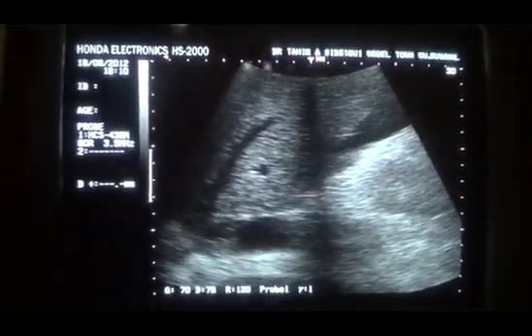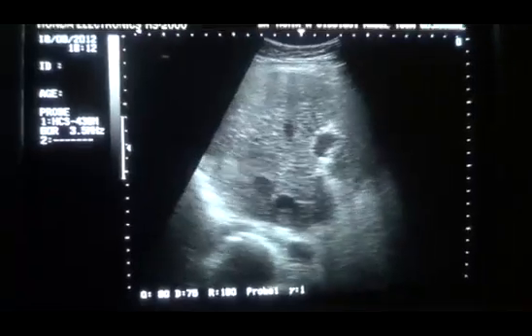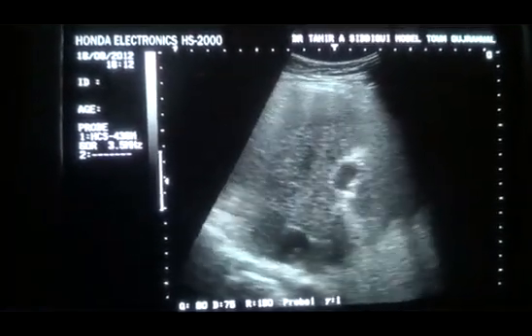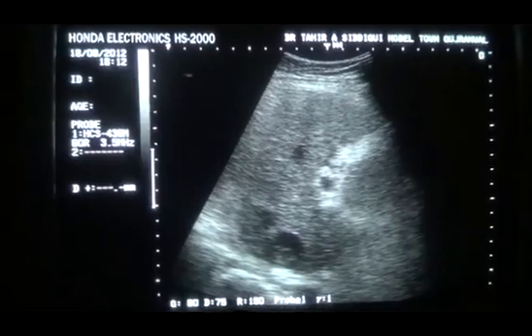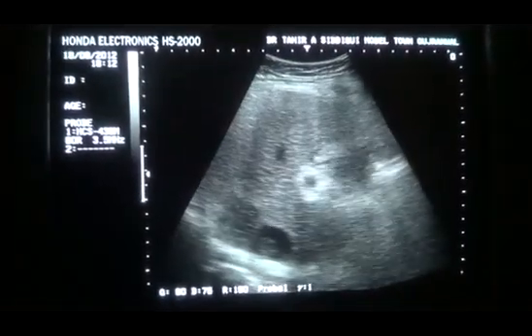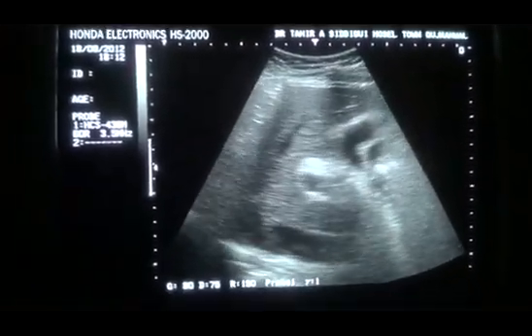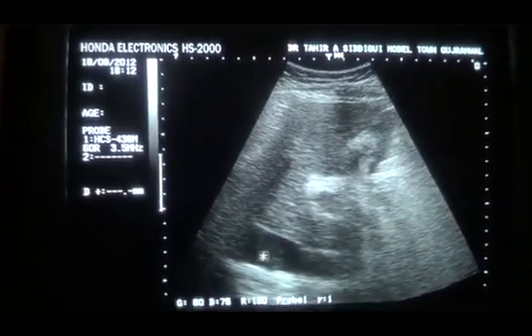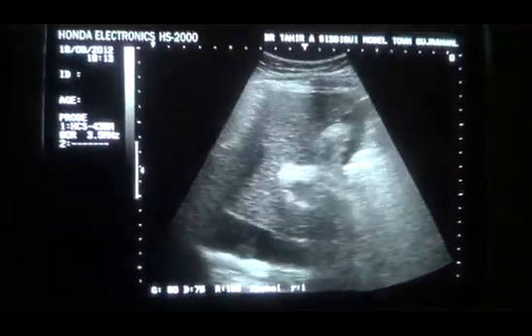This is the left lobe of the liver in longitudinal section. This is the left hepatic vein. Now, concentrate on this area: the transverse section of the IVC with a clot within. Now I am moving the probe 90 degrees. You can see that in longitudinal section there is a clot that is so far non-obstructive, because it is not occupying all of the lumen and not blocking the total IVC.